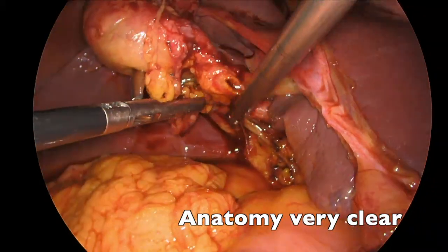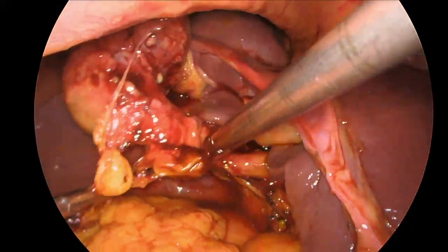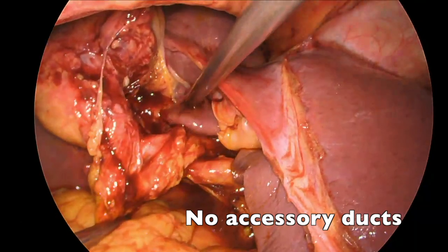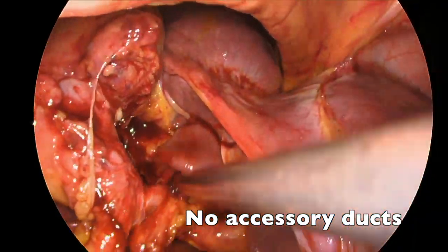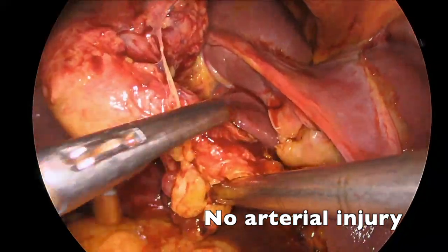In order to evaluate whether to repair now or otherwise, we can see the anatomy is very clear. There are no accessory ducts. We can clearly see this, and in fact it was so clear that I did not do a cholangiogram as a result. There's no arterial injury.